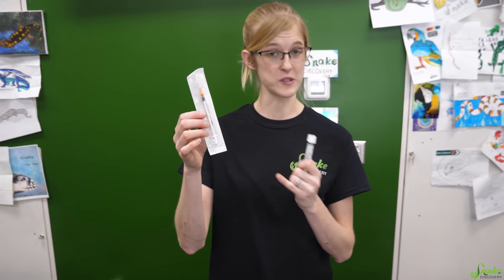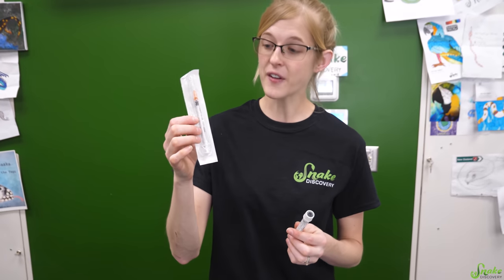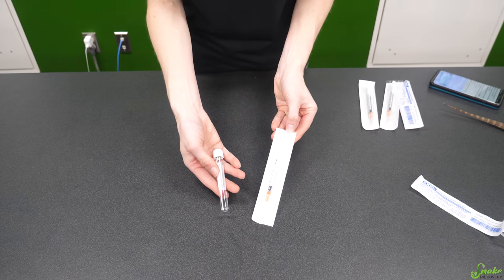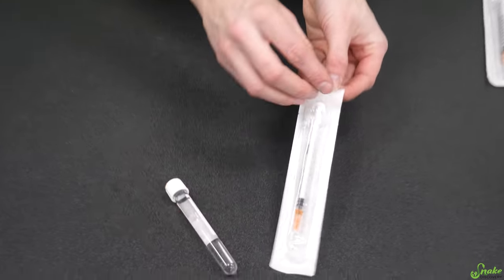Sometimes vets will send you home with a needle that's already dosed out, so you have exactly how much you need to administer into the reptile. Other times, you are given a vial of the medication and you have to draw it out yourself. So in case you fall into that category, we're going to show you how to do that. For the sake of today's video, we're just going to be using a sterile saline solution for our injection.